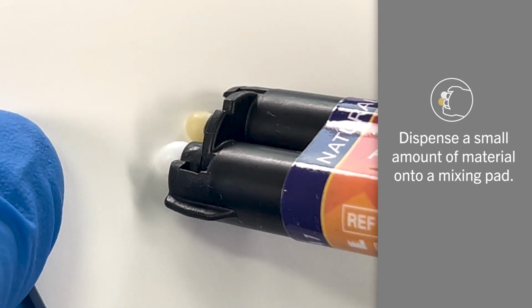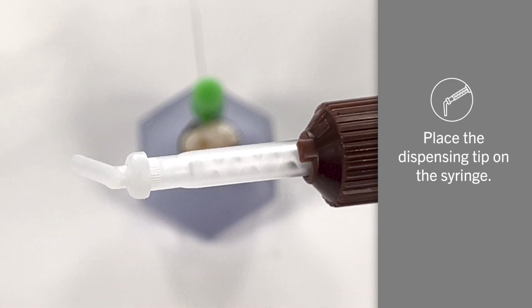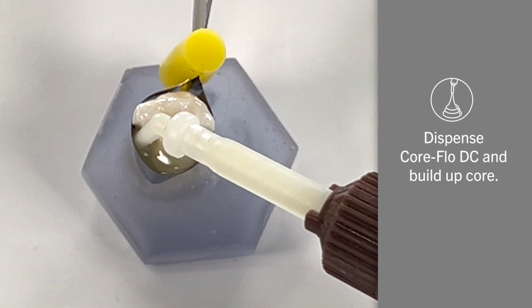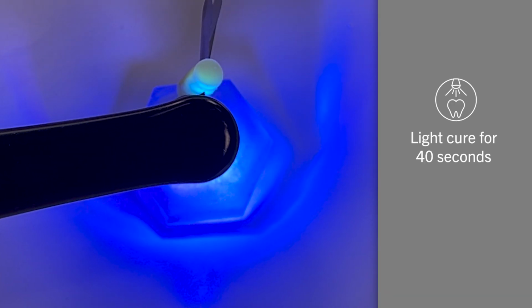Dispense a small amount of the material onto a mixing pad to eliminate voids and place the dispensing tip on the syringe. Dispense Core-Flo DC and build up the core to the desired height and shape. Light cure for 40 seconds.